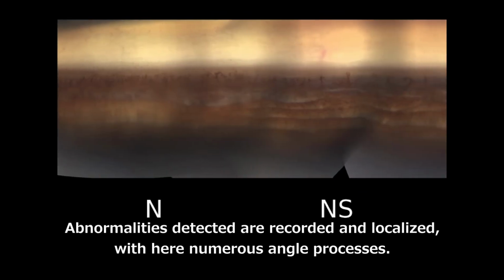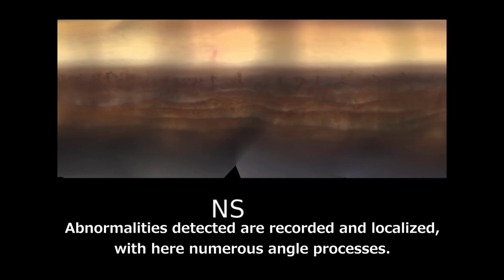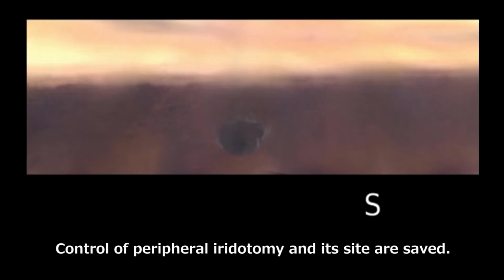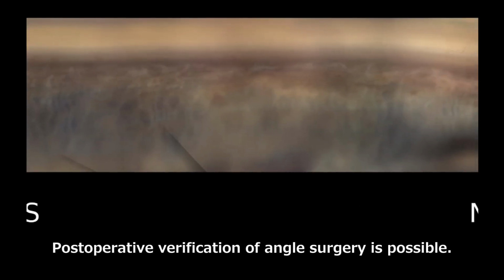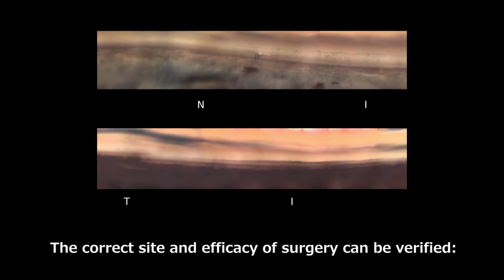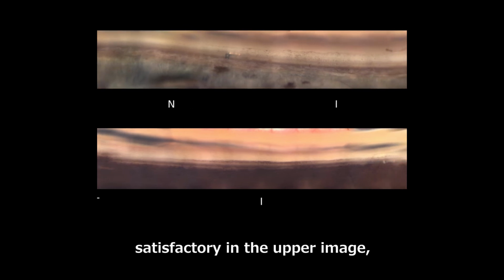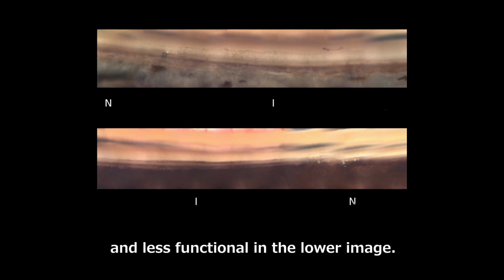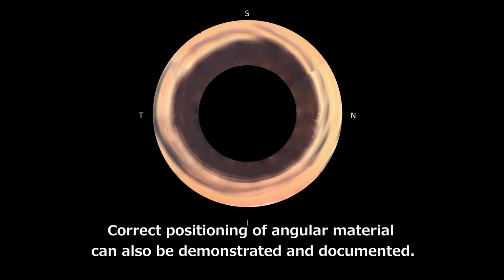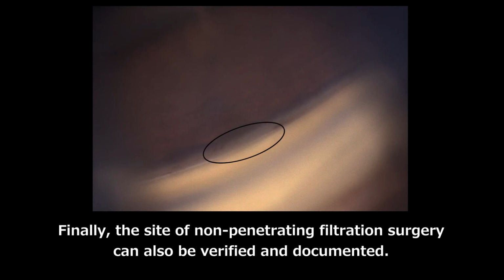Abnormalities detected and recorded are localized, with here numerous angle processes. Control of peripheral iridotomy and its site are saved. Postoperative verification of angle surgery is possible. The correct site and efficacy of surgery can be verified satisfactorily in the upper image and less functional in the lower image. Correct positioning of angular material can also be demonstrated and documented. Finally, the site of non-penetrating filtration surgery can also be verified and documented.